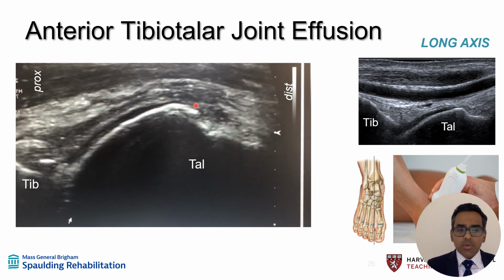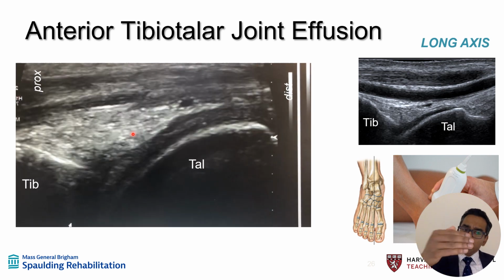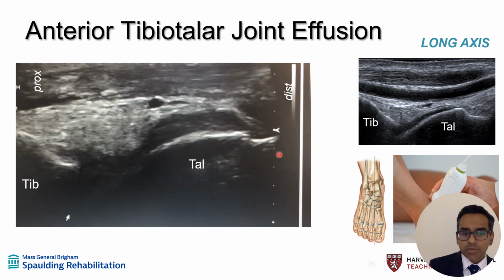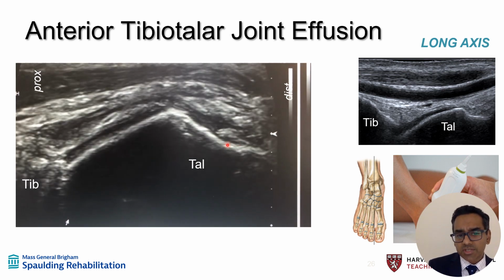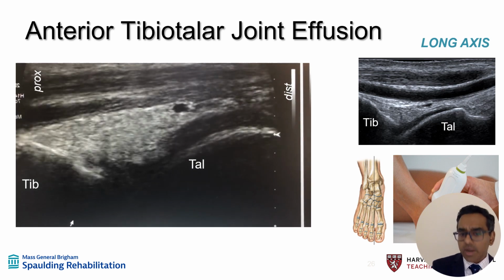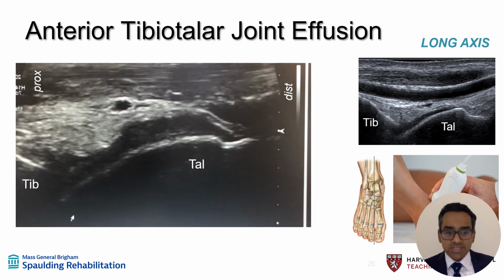As this video plays, notice how normal the cartilage looks here, and then as you move more laterally, we notice some increased hypoechoic signal. We also see, if we look very closely, in this area where the hypoechoic signal is, some bony contour change to another area of the talus. So more suggestions that there's something going on in the joint itself.